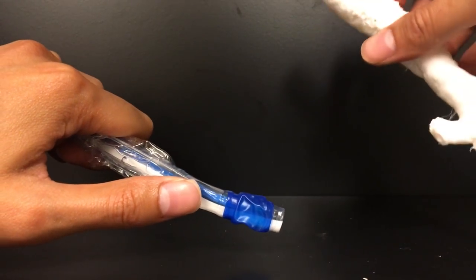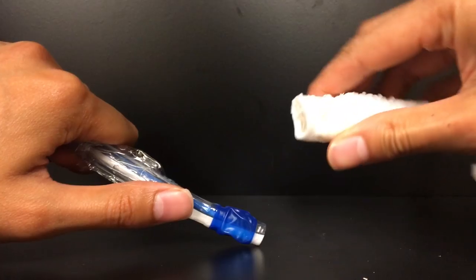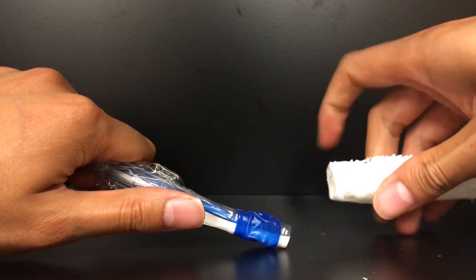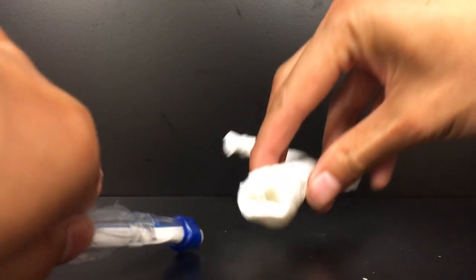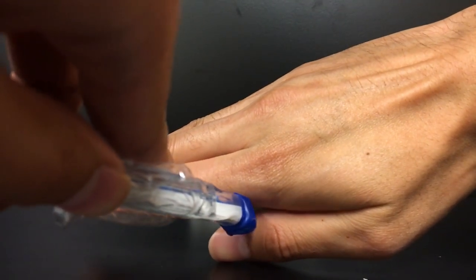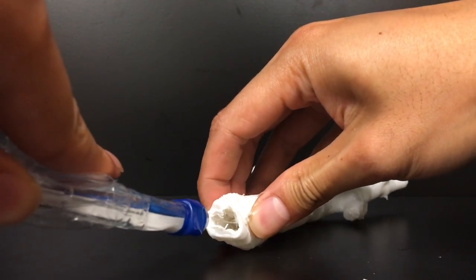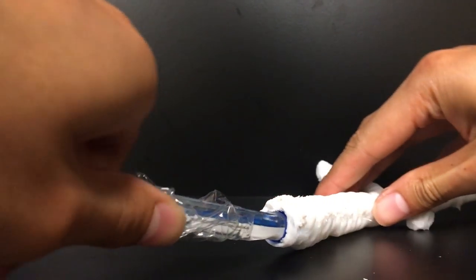Okay, let's try and do the test fit for the double lumen tube. So double lumen tube meets opening to the trachea. This is kind of tricky because of where my camera is. Obviously, when you actually do your simulations, you'd be doing it like this, right? And you wouldn't be looking at the trachea or the opening, this would be occluded like this, and you'd be trying to look at the monitor up there somewhere with the bronchoscope. But just before we even get to that part, we're just gonna see if it fits.